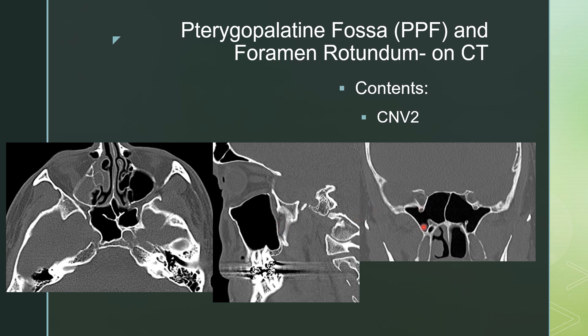If you look on the coronal view at the level of the pterygoid plates, here's the vidian nerve canal. Superior to that and slightly lateral is foramen rotundum on the coronal view, on the right and on the left.